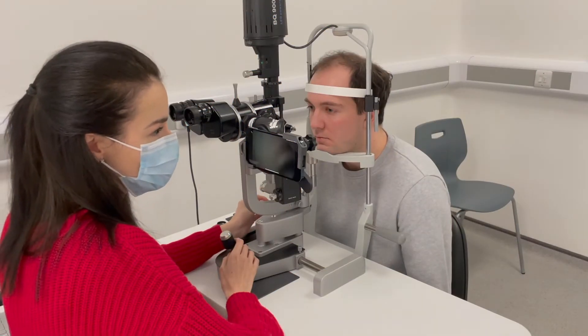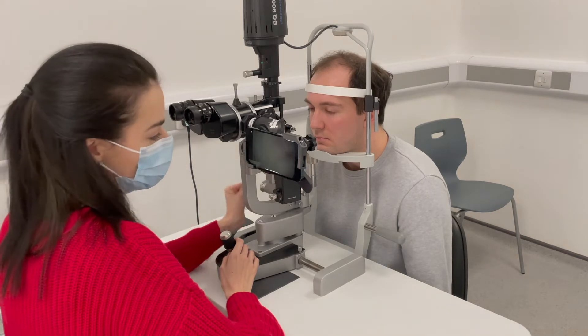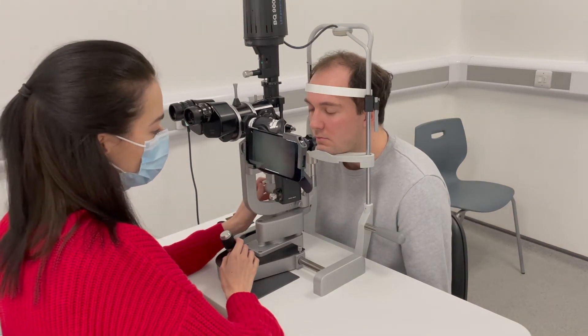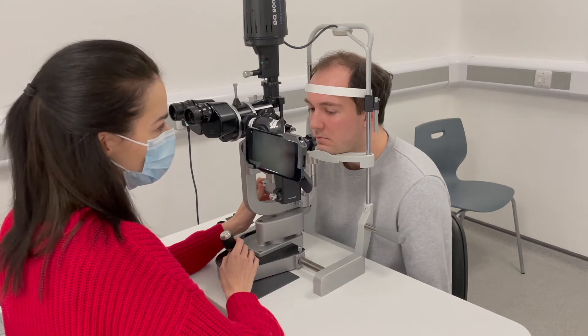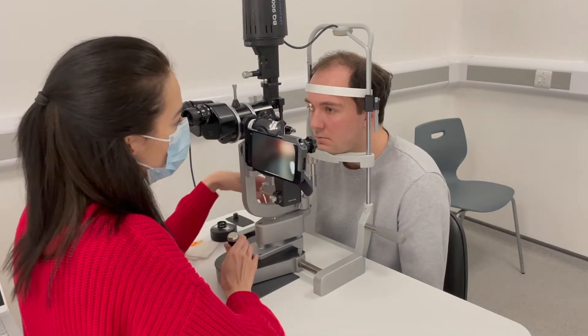Hi Sunel, so this is the patient I was telling you about. This young gentleman has been having headaches for the past few weeks. I just wanted to show you the examination and see what you thought. You know, these headaches — do they sound more neurological or do you think it could be related to the ocular surface? To me it sounds more ocular surface, but I just wanted to double check the discs to see what you think.